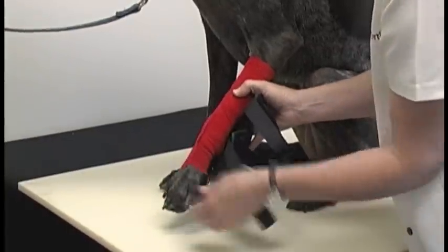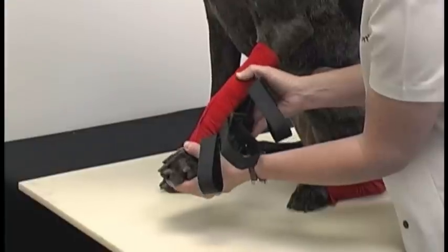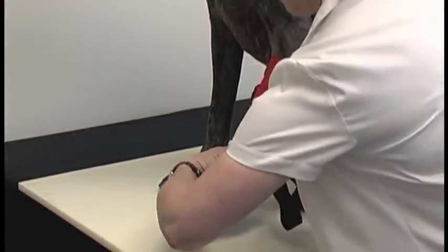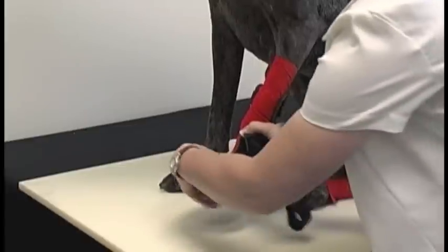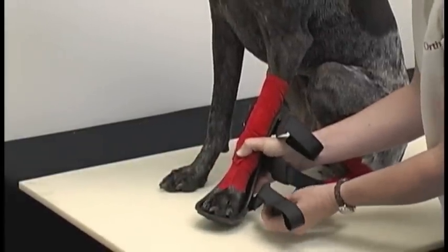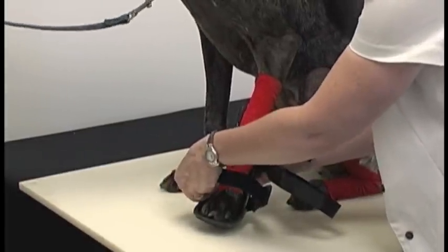You might have to have somebody help you fit as well — an extra set of hands is always helpful. You may just slide the foot right in there. Kind of lift the pads, just like that. Begin with the bottom strap first — that way you can secure the animal's foot in there nicely.